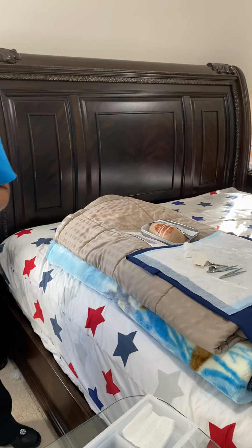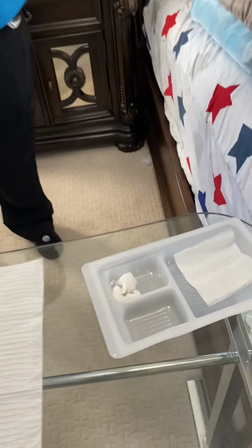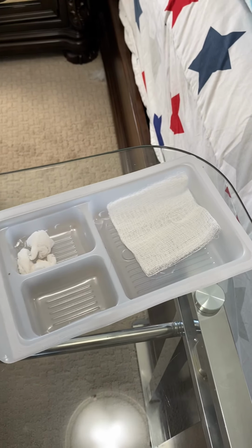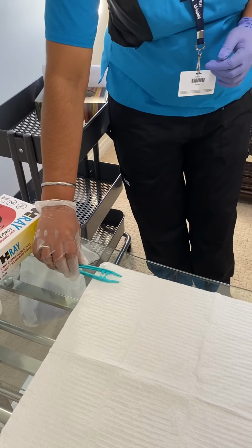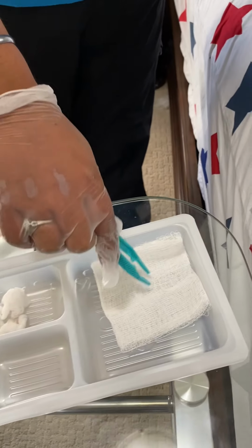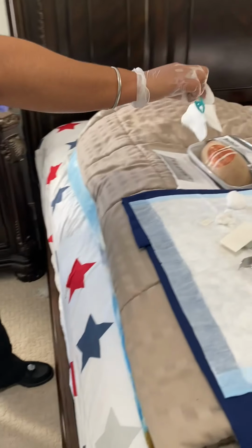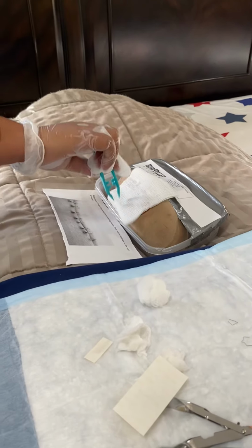Now that is done, I have to put the gauze over the steri strips. I didn't cross my field, so I have my green forceps, and I take my 4x4 gauze from the tray and put it on top of the wound.